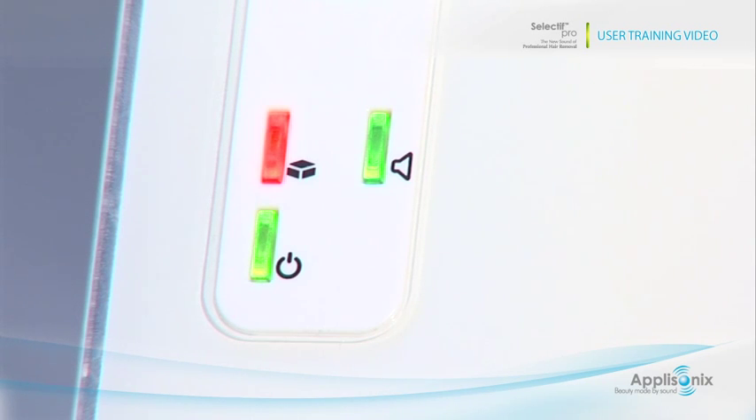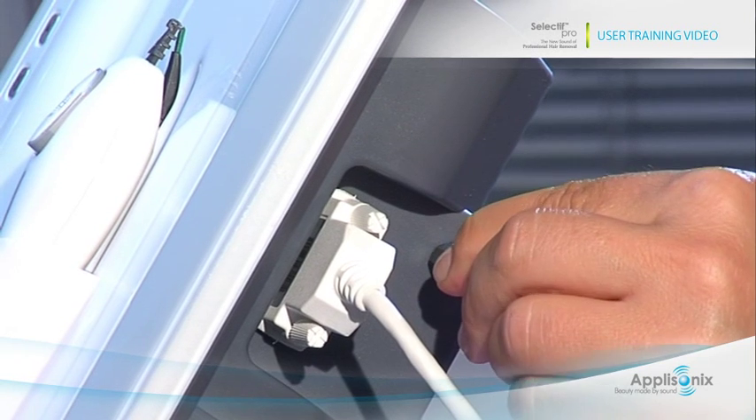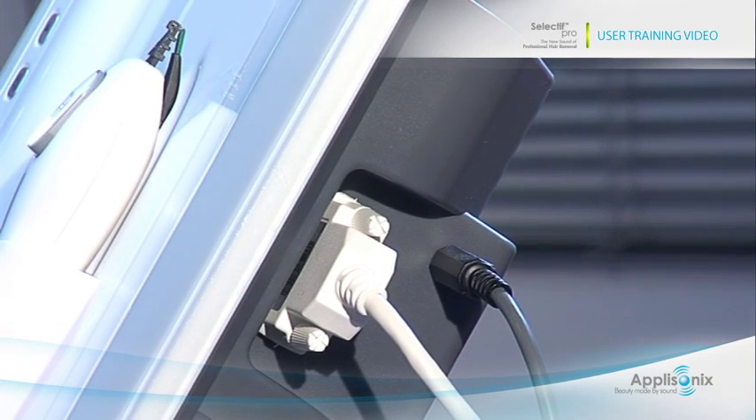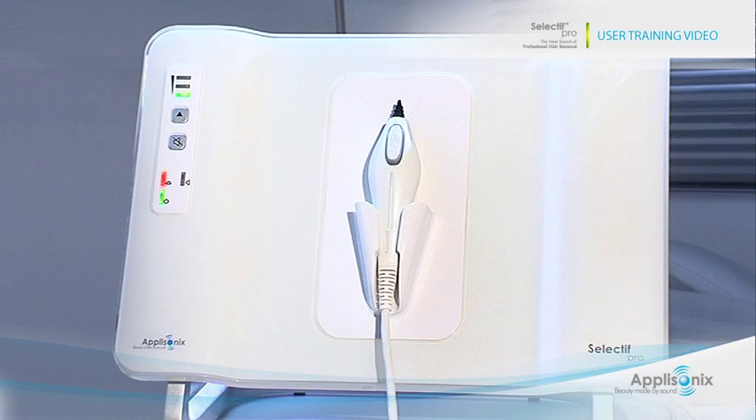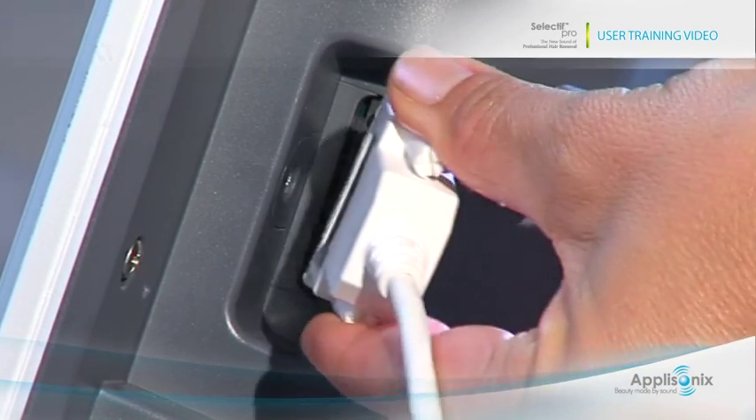When the status light is red, check that the foot pedal is properly connected and that the trigger button on the probe is not pressed. The mode and status indicators on the front panel will provide immediate notifications when there is a problem with the system. When the status light is red and mode A is blinking, the probe has been disconnected — turn the system off, reconnect the probe, and continue working.